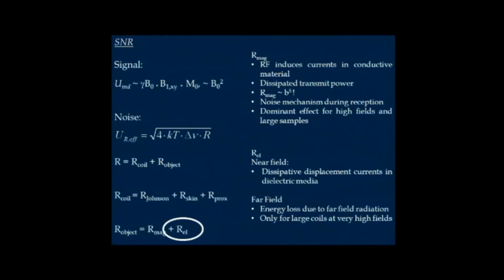This you want to avoid in an RF coil. You want to concentrate all the energy you put into the inner volume. If you have far field radiation, then by the principle of reciprocity you can receive with it as well, and you don't want to receive your local radio station with it. So you tend to keep all electrical fields outside of the interesting volume, and you try to symmetricize your electric fields as well as possible. Those two are something, this one especially, you can do something against.